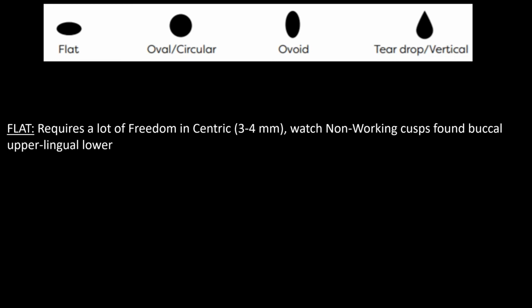And then I went in with good intentions, gave them teeth with cusps, locked the bite in, but now they needed to chew like a teardrop to make that work, because that's how it worked on the articulator. And of course, remember, there's a pattern. The brain has a repetitive pattern ingrained in it, and it's trying to do what it's been doing for years. Now all of a sudden we've changed the pattern, and what's happening? All the cusps are hitting and it's dislodging the denture.